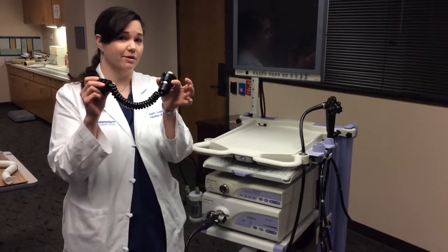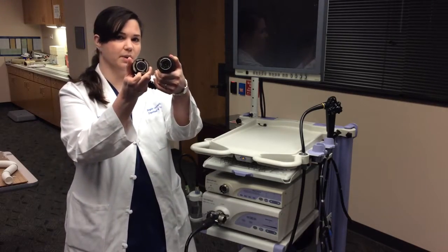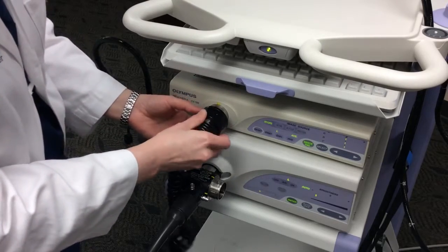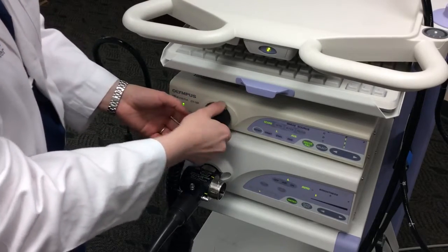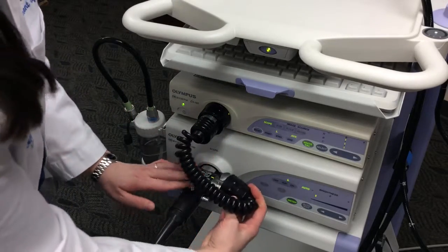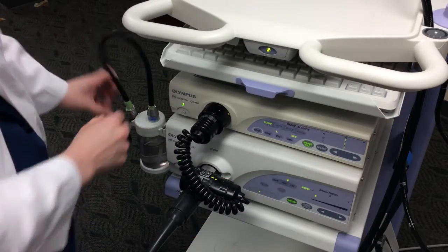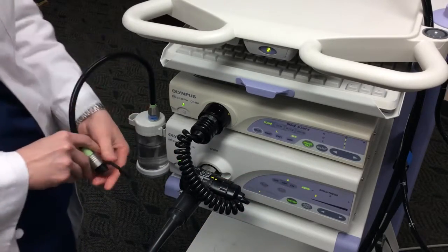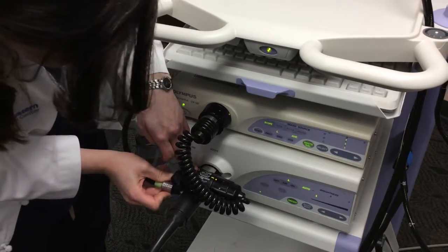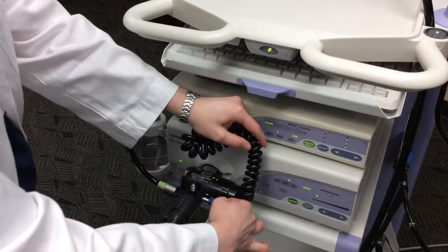this is the part that Parkland always forgets about. So if you look at them, one side has pins, one side doesn't. The side with pins goes on the top. When you put it in, you're going to put it in, line it up, and then you have to screw it in. And then same thing with this, you're going to line it up and screw it in place. All right. The next part of the scope is you want to hook up the water supply. It goes on the side here, so you plug it in here and twist to push it in. Finally, you want to set up your suction.